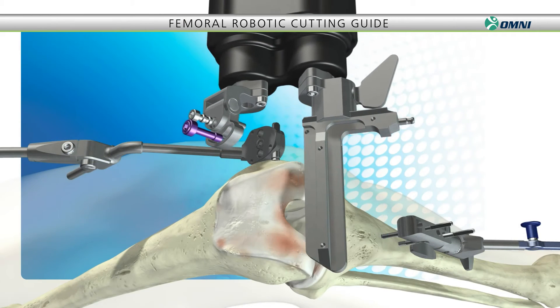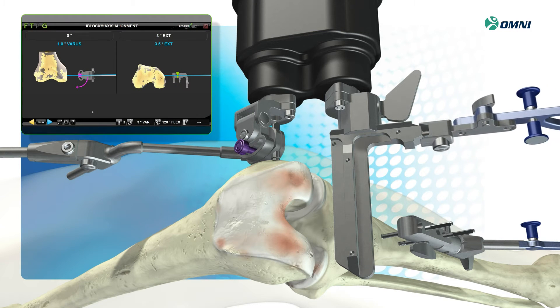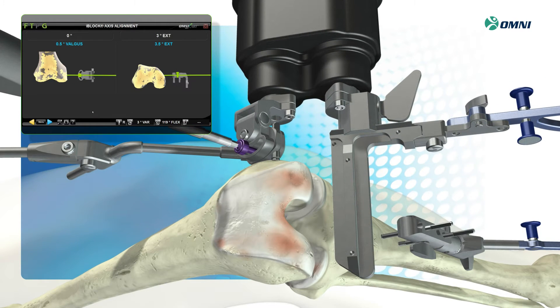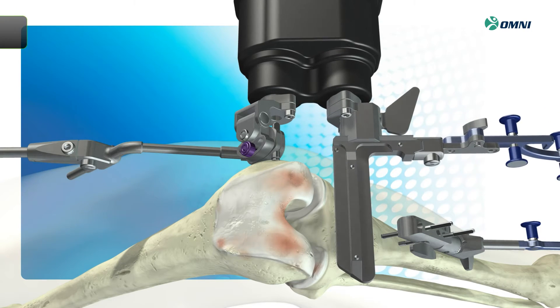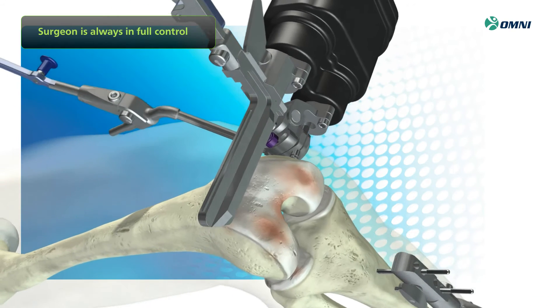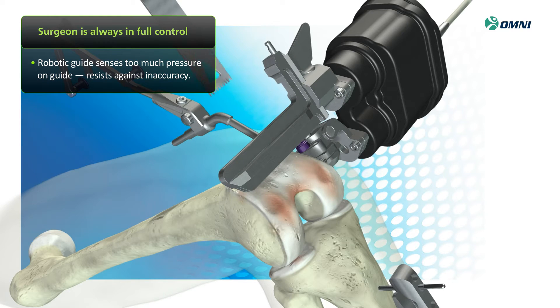First, the robotic cutting guide is placed into the femoral fixation base and fixed into proper alignment. After the system performs a calibration, the cutting guide is positioned to make the first distal cut. The surgeon is always in full control and can make any final adjustments necessary before performing the bone resections. As you carry out bone resections, the system also senses if there is too much pressure on the cutting guide and will resist against inaccuracy while notifying you with an audible tone.